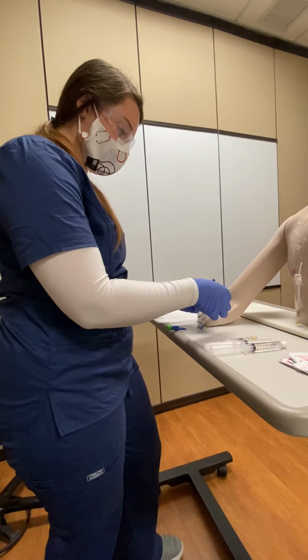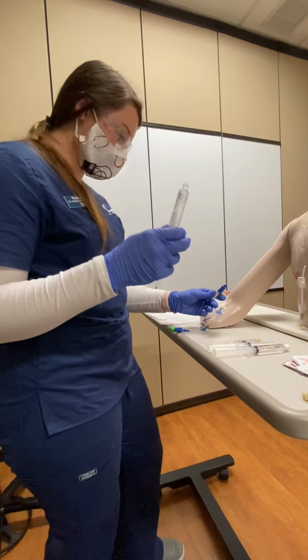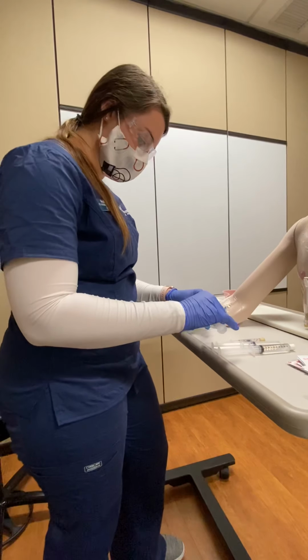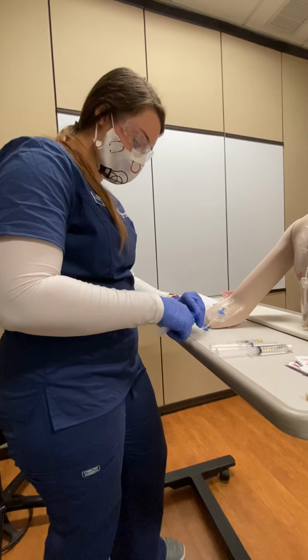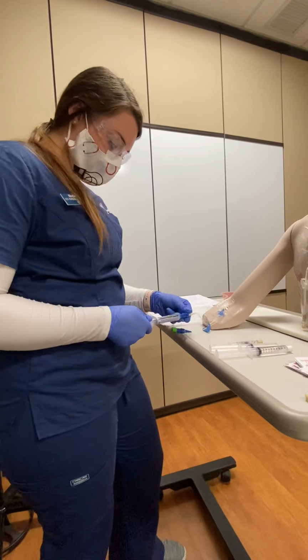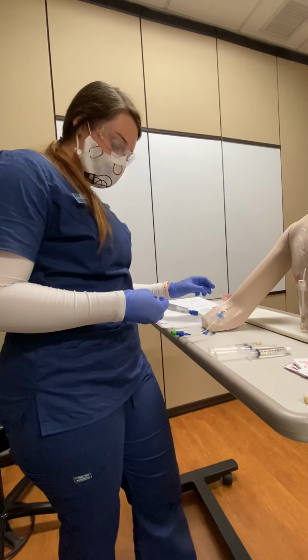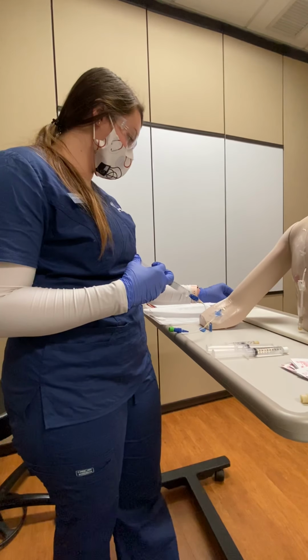Okay. I'm going to get out the air. All right, air's out. And if there was heparin in the line, I would use an empty syringe and take out the heparin. But in this case, there is no heparin in the line, so I'm going to unlock, check the patency, and I'm getting blood return, so there are no blood clots forming. All right, so now I'm going to administer this normal saline.